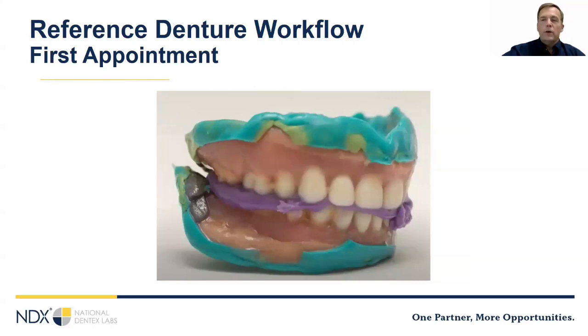So the first thing you'll want to do is scan your whole reline denture with your IOS, both the intaglio surface and the external surface. So you've created a 3D registration of the reline denture. Then you'll scan the opposing arch or the opposing denture. You'll scan this extraorally. And then you'll place a reline denture or dentures in the person's mouth with the bite and scan both sides of the arch to digitally capture the bite. Again, you'll want to note any changes that need to be made and send the scans to your laboratory. You can remove the impression material and return the denture to your patient. It helps to use a little bit of alcohol to clean that adhesive out.